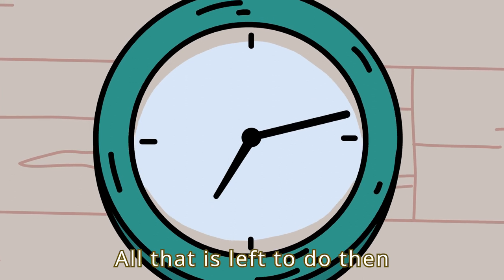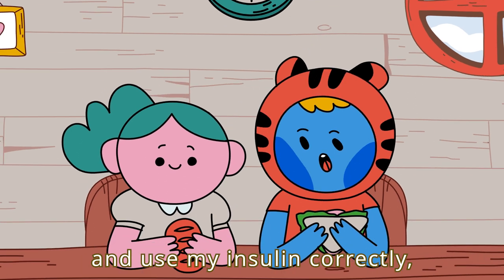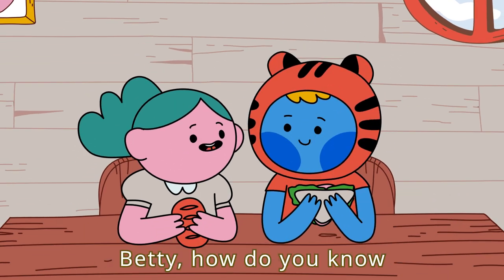All that is left to do then is wait until I can eat. If I follow these steps and use my insulin correctly, I feel happy and healthy. Betty, how do you know how much insulin to take?